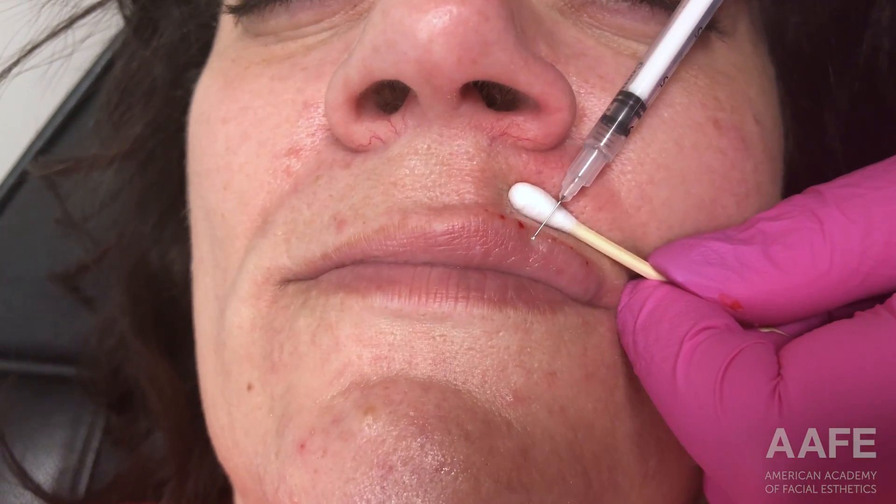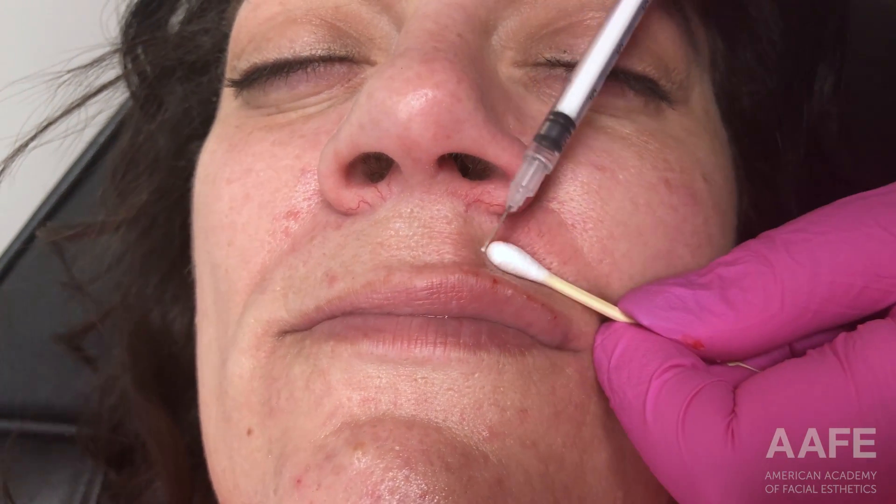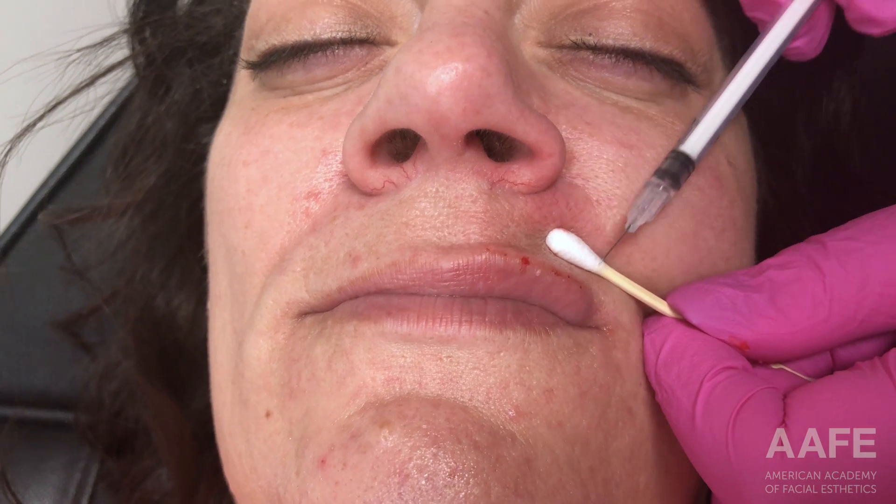You can see that I have the filler backfilled into a smaller syringe so that when I'm doing this AFE right-angle technique I can really control how much product I'm pushing. Not very much is coming out with every injection because with this technique we're a little more superficial, so we don't want to risk any tindling or pushing so much product that it bubbles up and becomes too superficial in the lip. Backfilling into these smaller syringes really helps control how much product you are pushing.